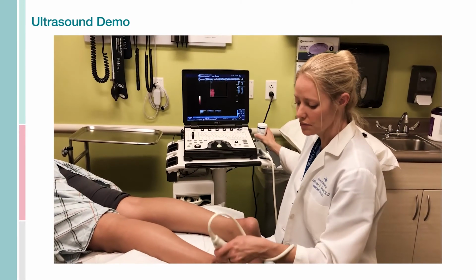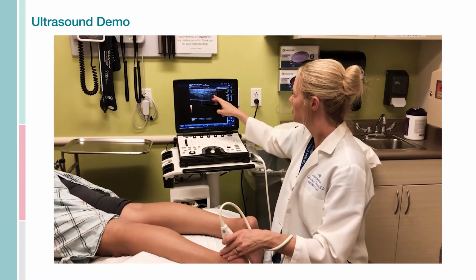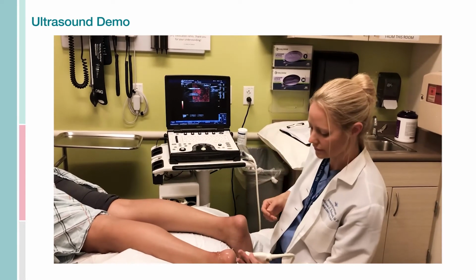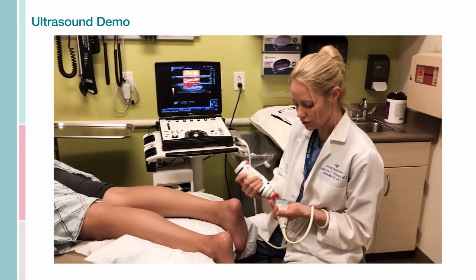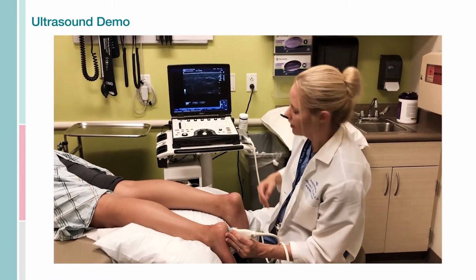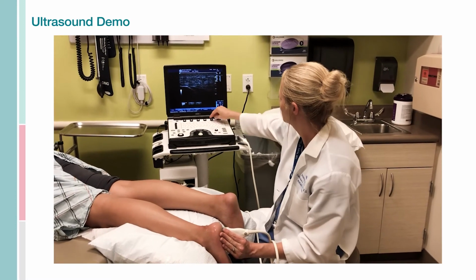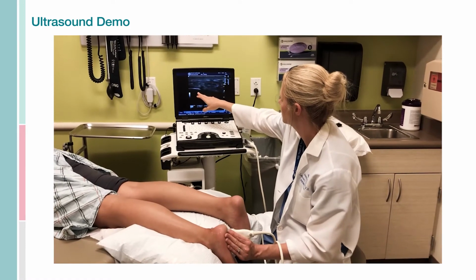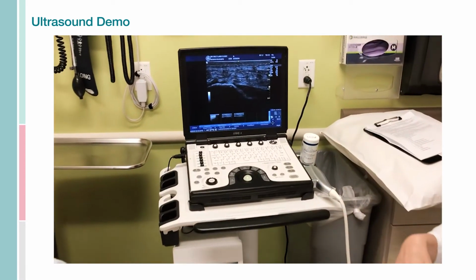And once again, I'm not setting the best example for you, just make sure to apply as little pressure as possible. If you can't actually see the layer of gel, that's fine, but just remember to have a gentle hand. So last but not least is going to be the plantar fascia. For this ultrasound examination, what you want to do is try to, again, capture your grayscale B-mode, adjust your focal points down as necessary, looking again for that same hypoechogenicity and thickening. So here calcaneus, here plantar fascia across the length of the screen.